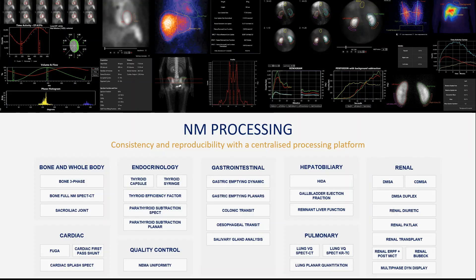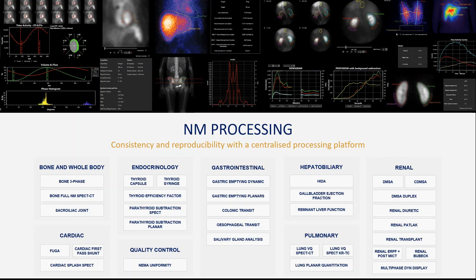For thyroid uptake calculation, we can use either an efficiency factor for the camera or images of the syringe pre and post injection to make a sensitivity factor.